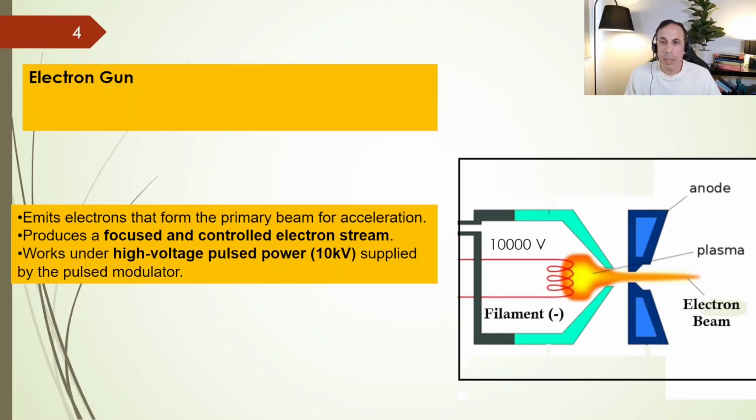You end up with pulsed electron beams because the electrical pulse coming from the modulator is pulsed, not continuous, producing an instantaneous electron beam current on the order of milliampere. So the electrons are produced at 10 kilovolt and on the order of milliampere. It is not a big electron beam.